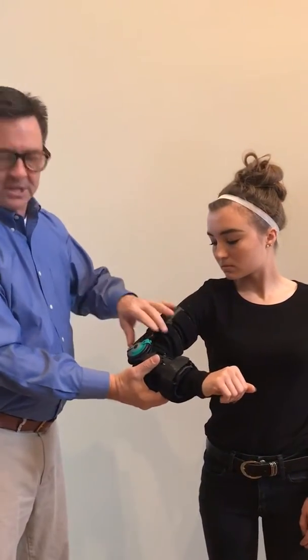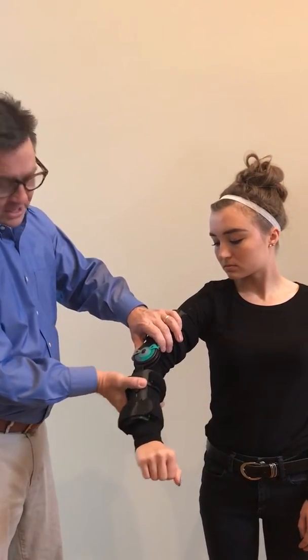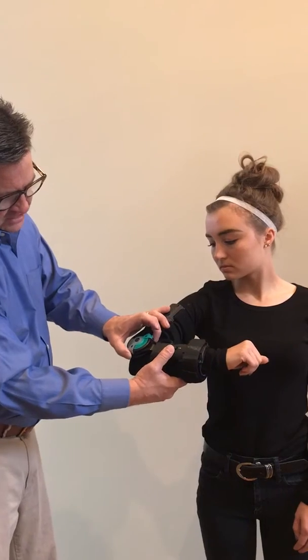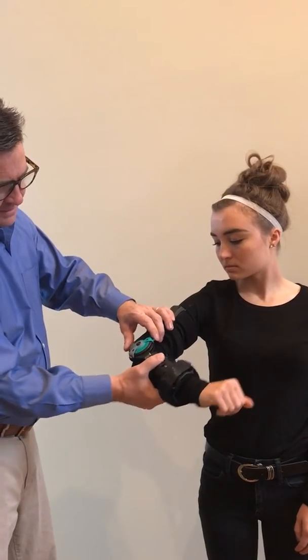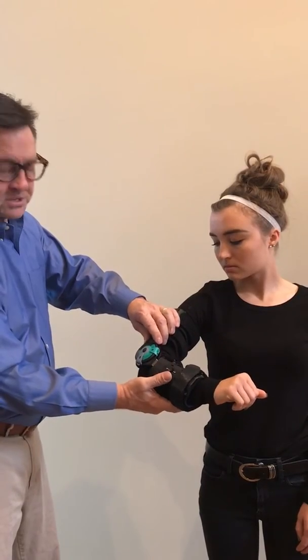Now that the brace is on, you can adjust the hinge. The hinge right now is set for wide open flexion and extension. You push the top button and can slide it forward to prevent further extension, where you can lock it at different angles as you see necessary.